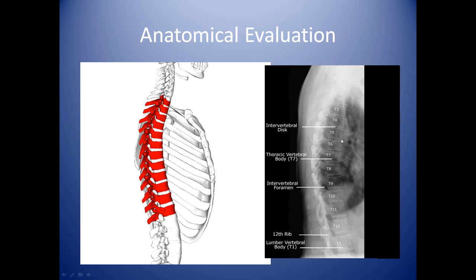Also look for the anterior vertebral body lines — that's often the easiest way to start counting. A good lateral thoracic spine is very much like a lateral chest x-ray. Include the spinous processes in the back. If you have ribs rounding out behind, make sure you don't have too much of that, because too much will constitute a repeat. This is what you're looking for to achieve a good lateral thoracic spine. That concludes our evaluation and review of thoracic spine x-rays.